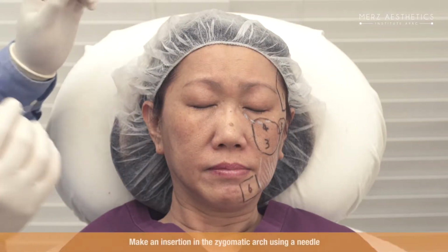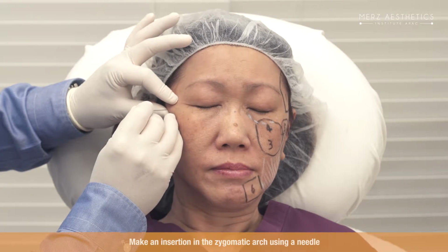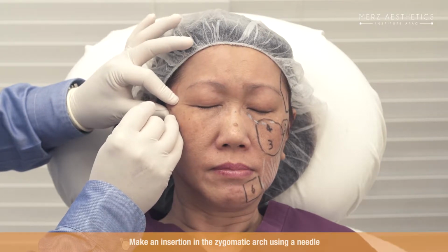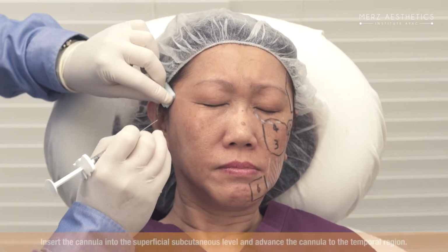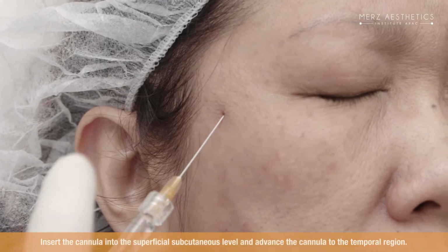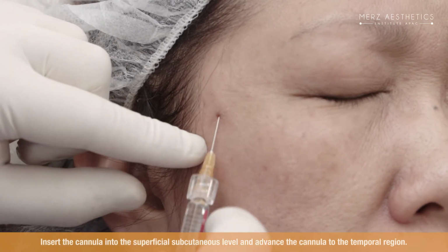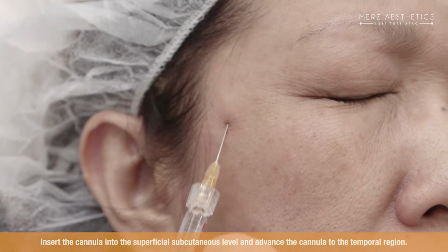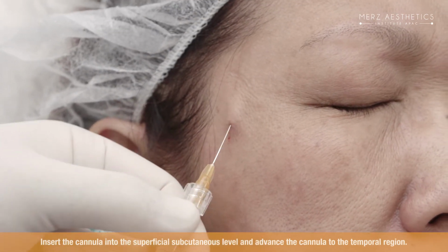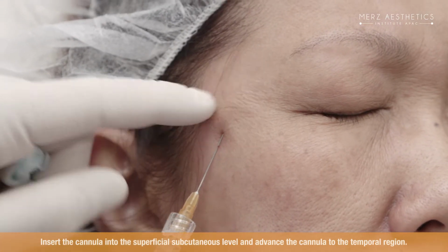The first injection is into the superficial temporal fat pad. Make the insertion in the skin over the zygomatic arch using a 23-gauge needle. Then insert the 25-gauge cannula and advance the cannula to the temporal region. The depth of injection should be in the superficial temporal fat pad. The cannula should be moved gently to avoid puncturing the superficial temporal artery.